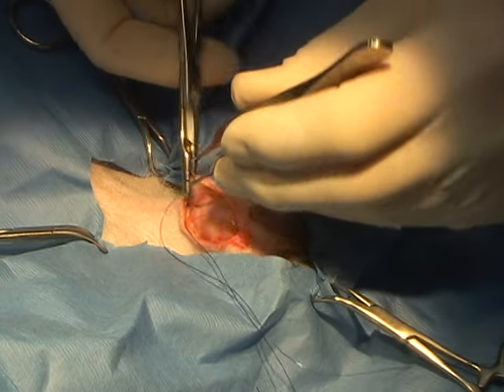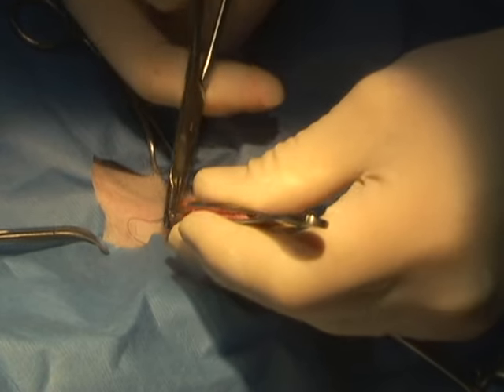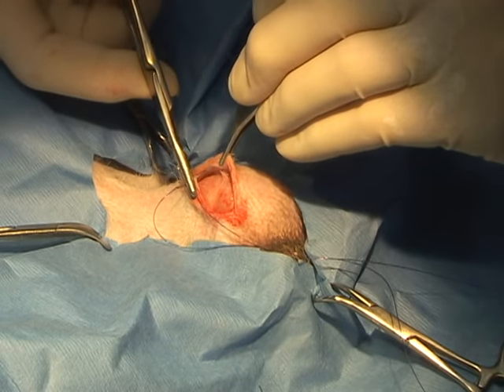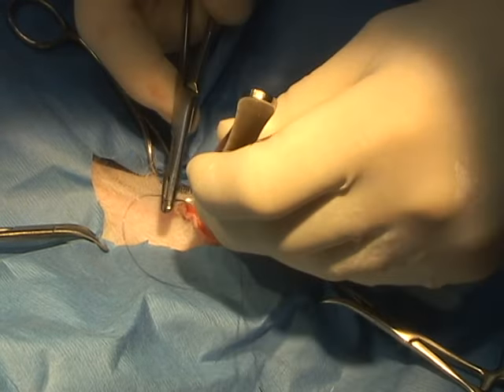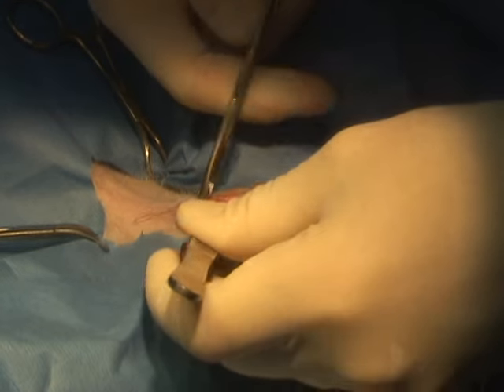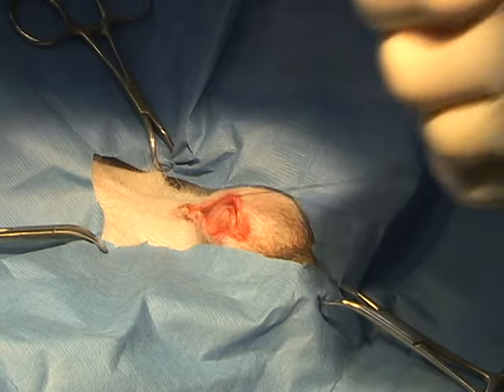When we do our subcuticular suture, as we do our passes, we will also take a fascial plane bite, so that the incision stays intact in the center, and we're obliterating the dead space underneath the incision. The whole procedure is very, very quick. The length of the procedure probably has a little to do with there being not much irritation postoperatively in the dog. The tissues have not been handled for a very long time. There's no drying of the tissue, and the dog's full anesthetic time in this case was probably only 15 minutes.